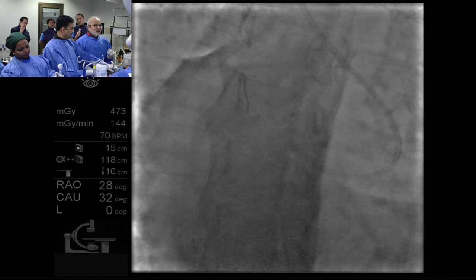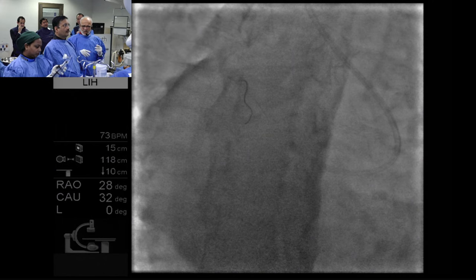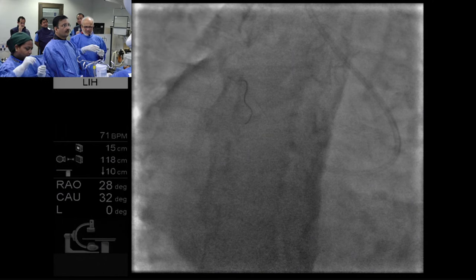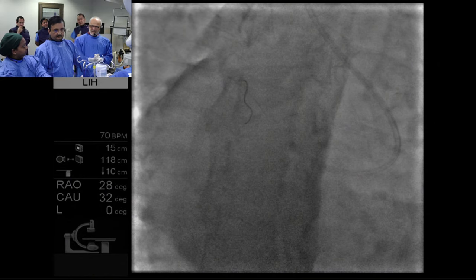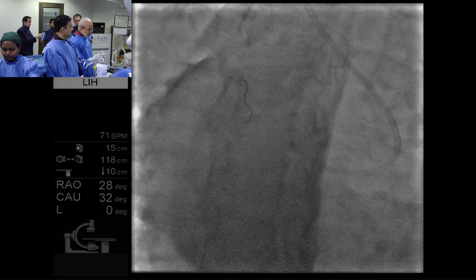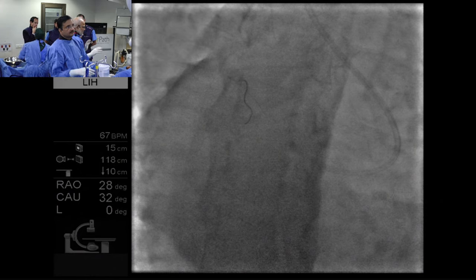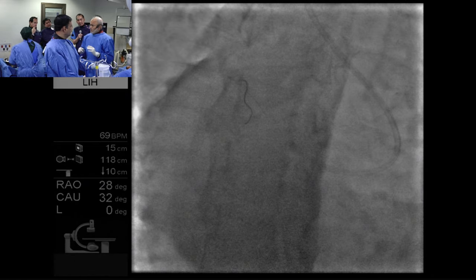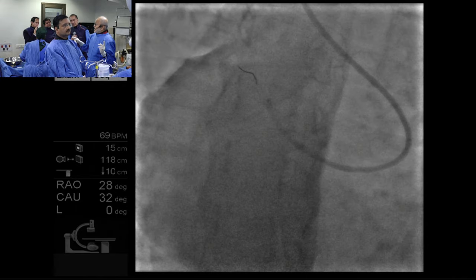But in our experience, every time I see the lesion, I presume what I am going to see in OCT, and then we see the OCT. In this case, the way it broke very quickly, 360 degree calcium or a calcific nodule we may not see. It should be a lot of calcium here and there, with differential thickness of the calcium. That's the reason why it broke.